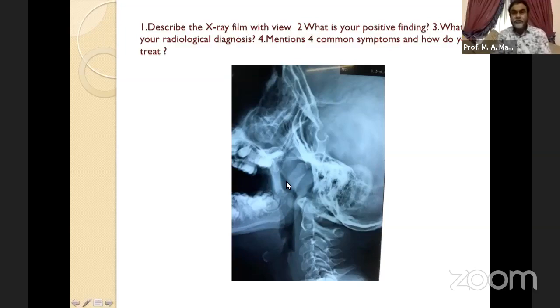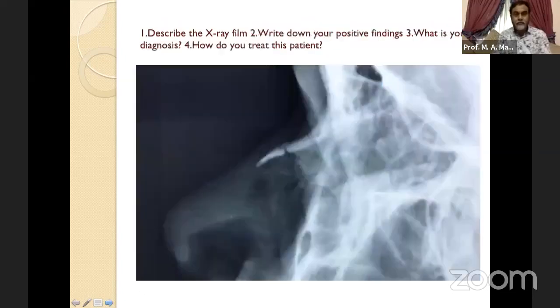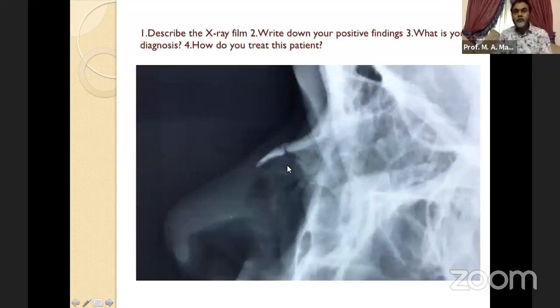How to differentiate antrochoanal polyp from adenoid on X-ray: in the case of antrochoanal polyp, the air column is posterior to the soft tissue shadow, whereas in adenoid, the air column is anterior to the soft tissue shadow. That is the trick. Now moving to another X-ray — the X-ray of nasal bones, lateral view, or X-ray face lateral view.